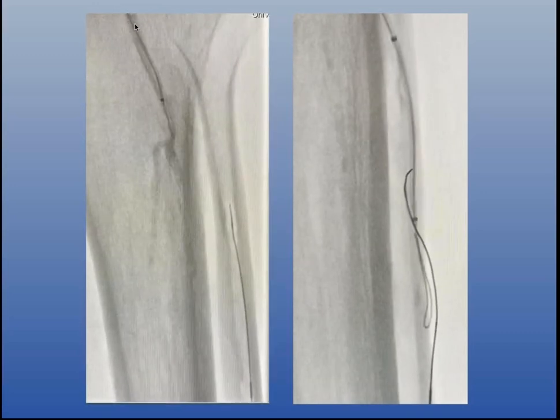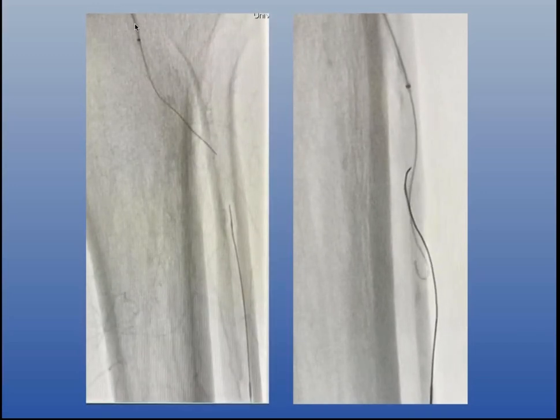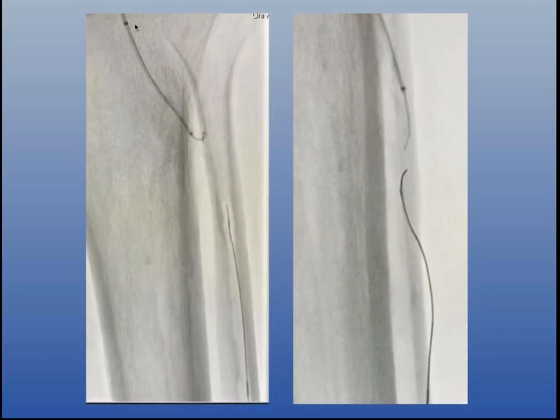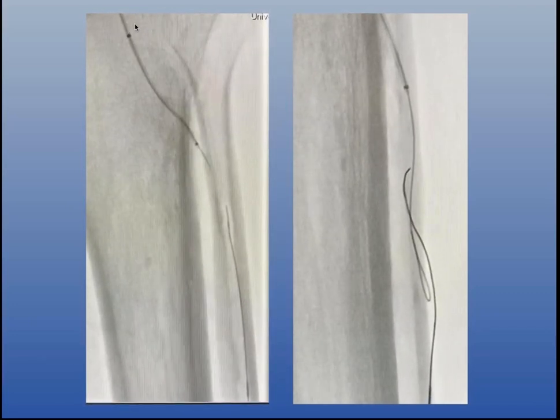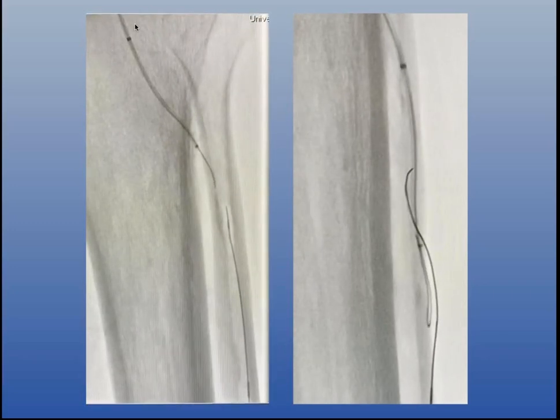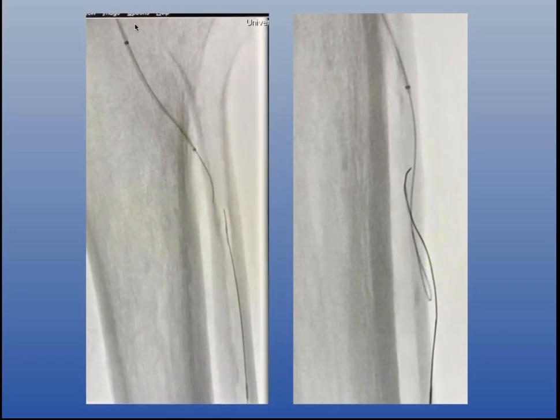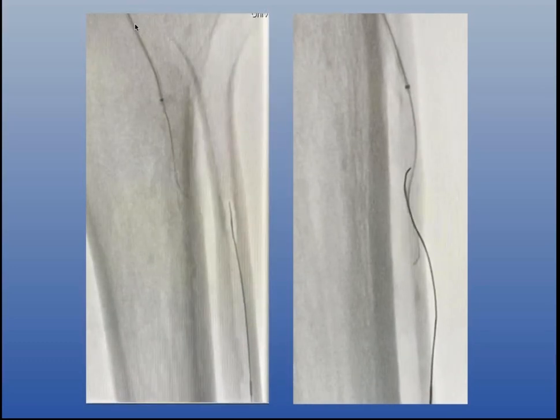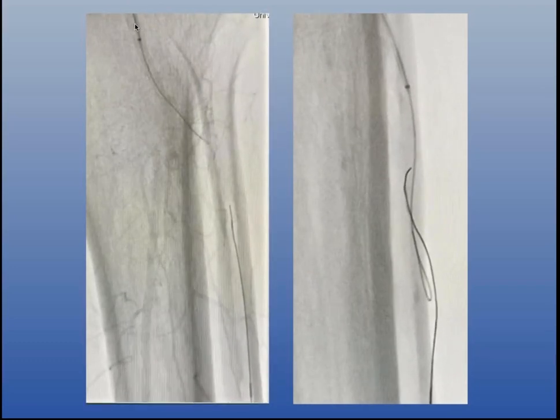And the way you can see that is you can see it on the far right, where I'm using, again, now it's a 4 French Navicross catheter. I advance it. The wires are crossing each other in different obliquities. If you notice that, see how that's crossing there? So when I did different obliques, they were basically touching. So I knew that there's some level of communication in that area, but I couldn't get the guide wire through even there. So I did some, what we went over, Navi-bossing.